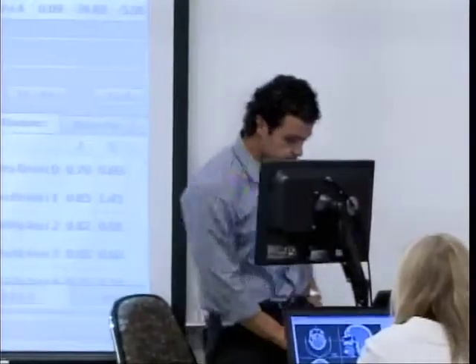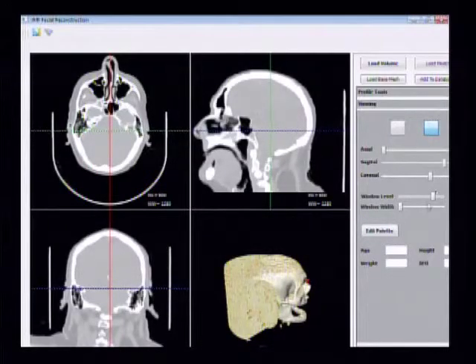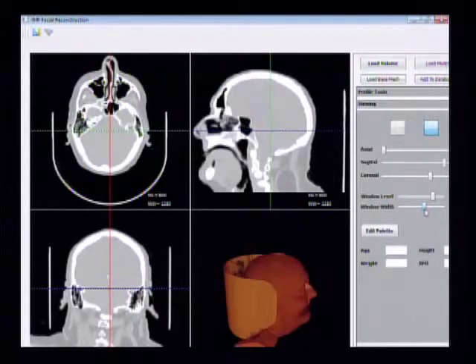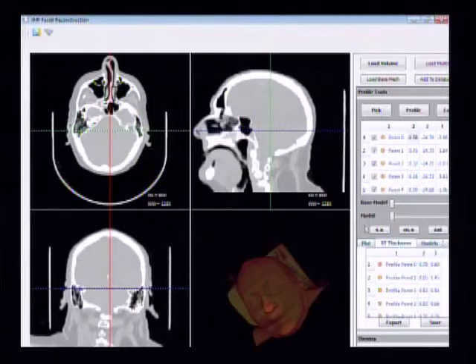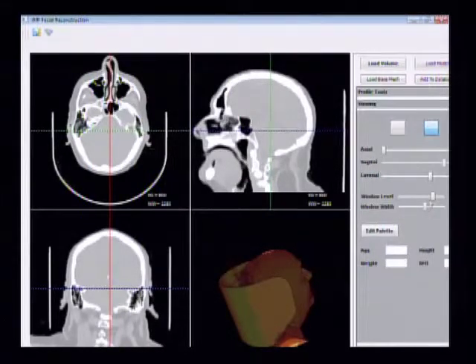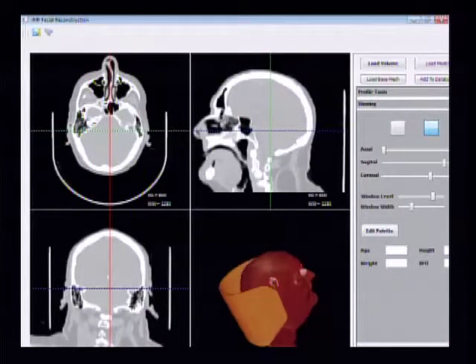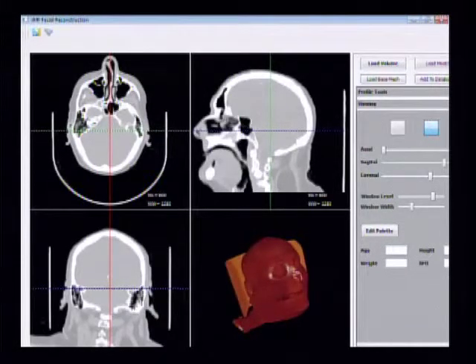Okay, so if we go back to the viewing tools and overlay the volume on top of that, and let's play with it, so you can see where the end of the skin hits the line. Okay. Oh, it's too dark. Let me try to. Can you see it now? Yeah, so the red lines are basically the lines from the skull bone to the skin surface. Right here. Everyone see these lines? Okay.